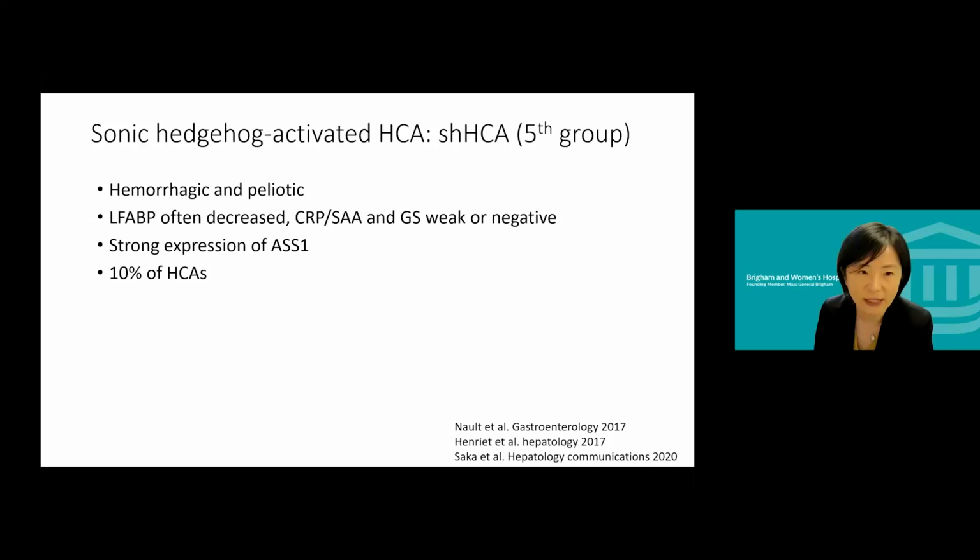So we don't really try too hard to diagnose this category. The articles estimate up to 10% of adenomas may belong to this category, but as of now, we do not diagnose this specific type, and this would be adenoma, NOS.